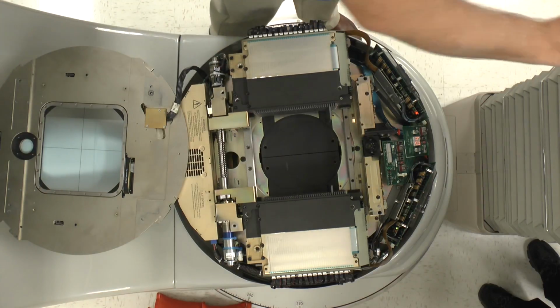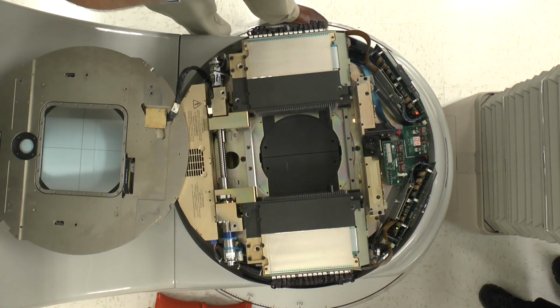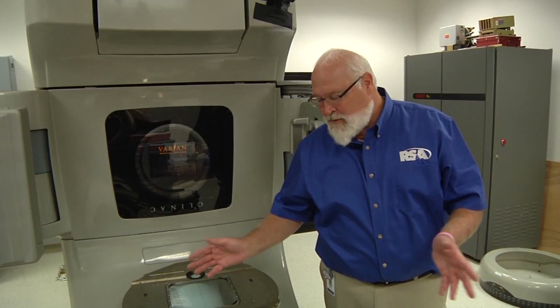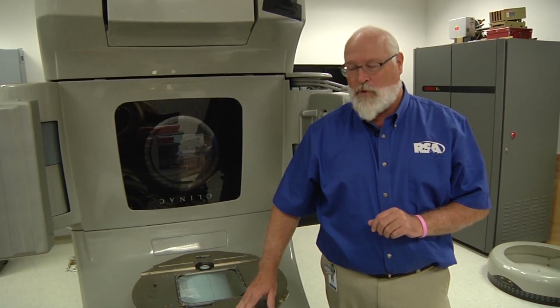Sometimes when you're rotating the gantry, your engineer will say, I hear something moving in the head. Well, that's important, because it'll fall down, and it always falls and hits the mirror. Everything else it'll miss, but it'll hit the mirror. So you always want to close the jaws when you take the cover off.